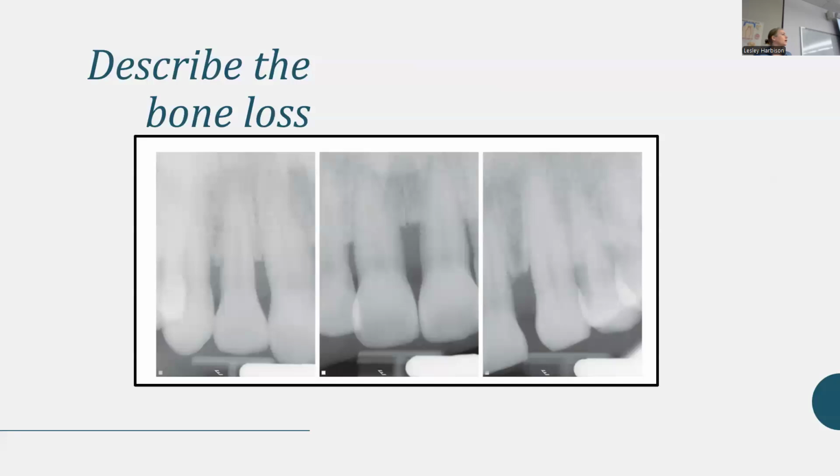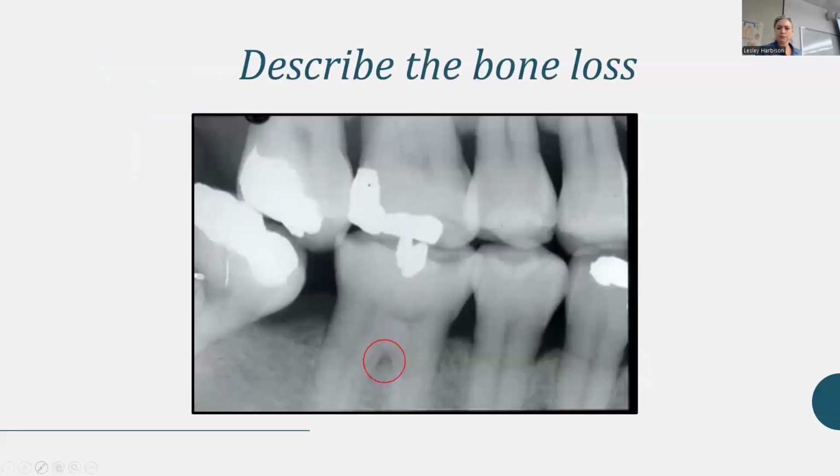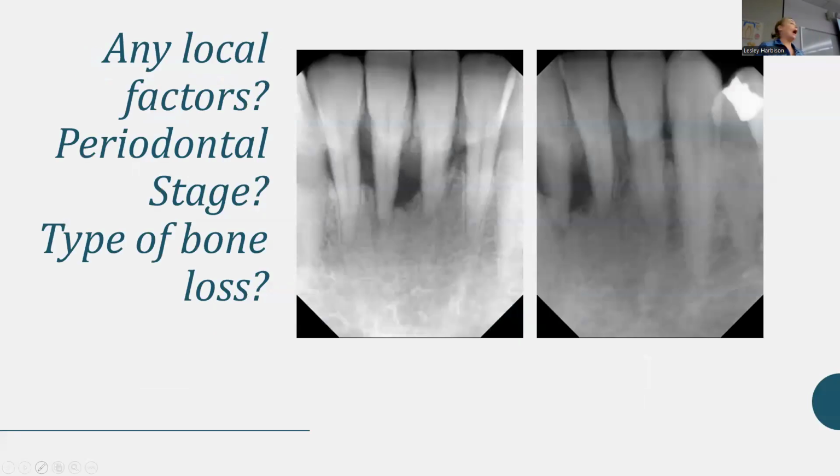You had it at stage 3 and 4. What separates the 3 and 4? Because we don't have that clinical aspect, we just say 3, 4. So that's the only time you will ever say that is in this radiology class because all we're looking at is radiographs. So we just don't have that full picture. So it's like 3, 4. I mean, you can say definitively a 4 if it's like that.